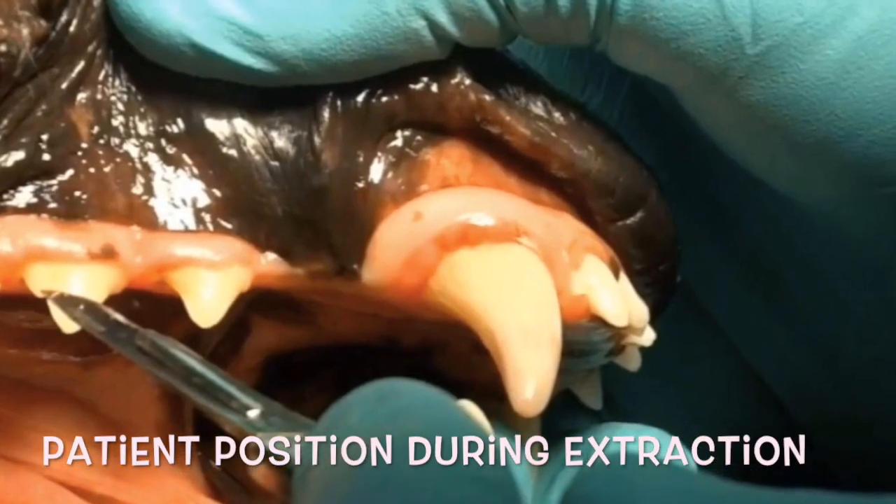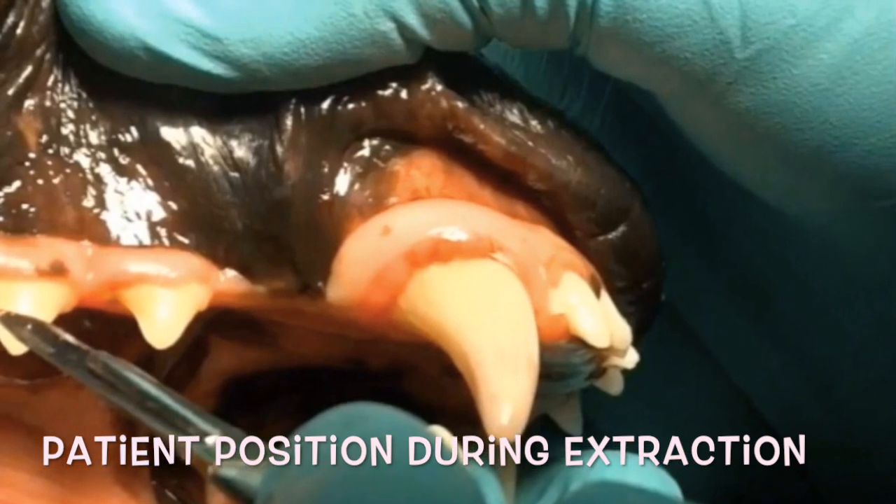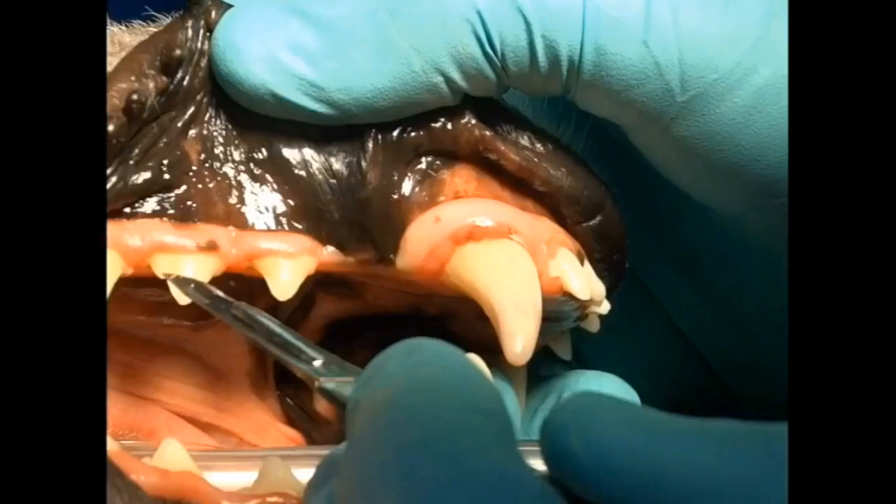Let's move to how the patient is positioned. We want maximum visual exposure to the patient, and we want to be able to place our luxator or elevator to progress to the apex down the groove we create around, say, a mandibular canine tooth. We want to use forward motion — from our body to the patient's body — not top to down. This way we can apply forward force, and the crowns facing us satisfies that requirement nicely.